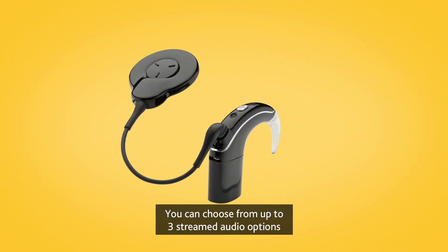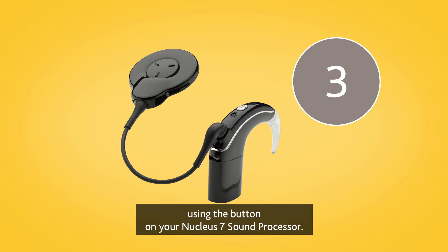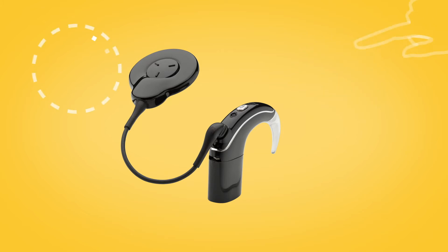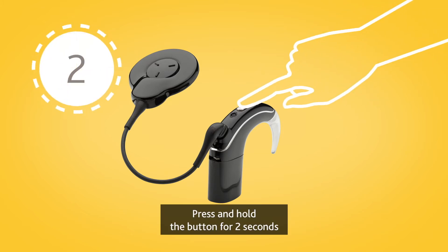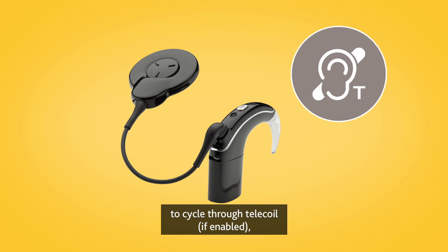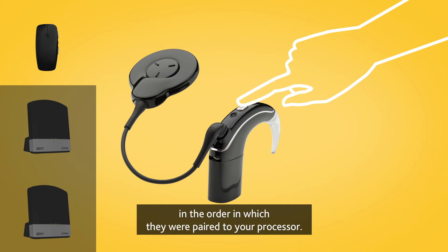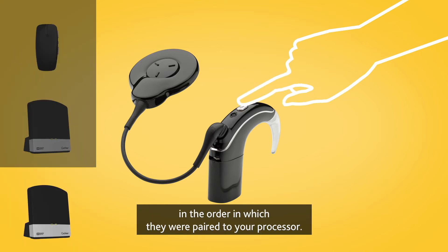You can choose from up to three streamed audio options using the button on your Nucleus 7 sound processor. Press and hold the button for two seconds to cycle through telecoil, if enabled, and then your True Wireless accessories in the order in which they were paired to your processor.